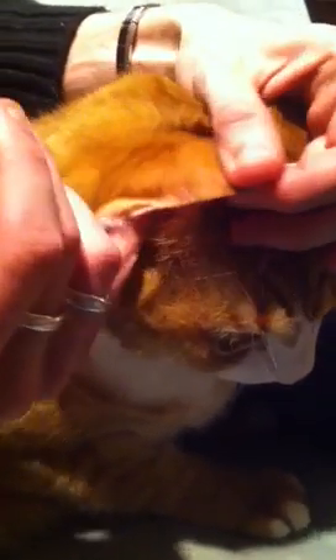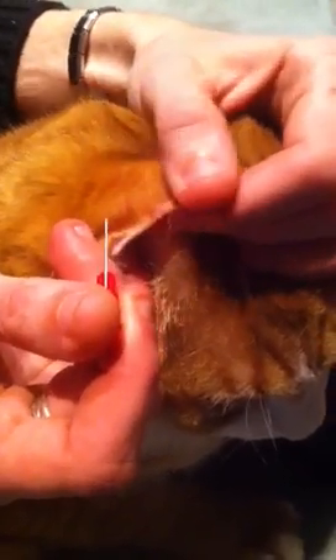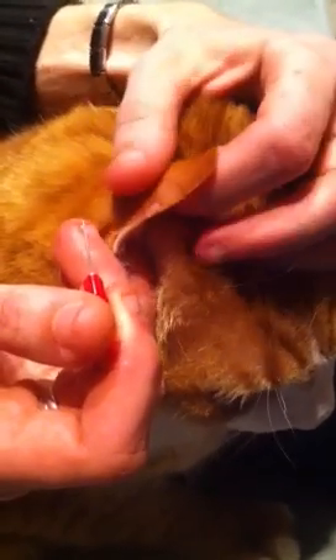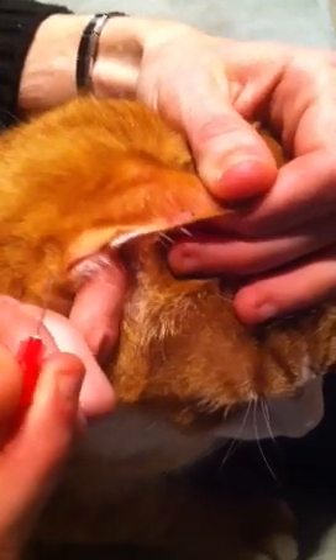With your other hand, pull the ear taut. There's usually a little bit of a color shift in the ear, and that's usually what I aim for, but you're just going to get a feel for it. You may see the vein, but you may not — and you don't need to spend a lot of time absolutely trying to see it. We could do this in the dark, practically. The vein just runs along the edge of the ear, approximately the same place in all cats and all parts of the ear.